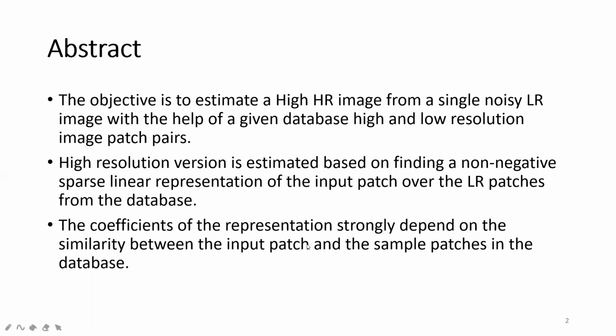After that, the coefficients of the representation. This method strongly depends upon the similarity between the input patch and the sample patches in the database. That means the database contains a number of patches. So if we are giving a single low resolution patch, that must be similar to the database patches, so that we are giving similar patches into the database. Then only we are expecting highly resoluted patches. This is the clear idea about this method.